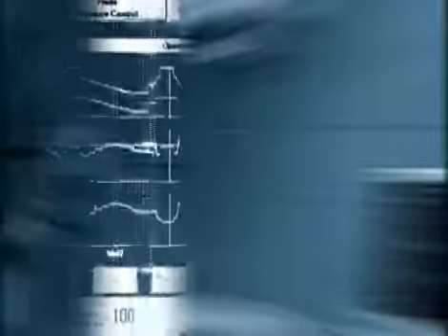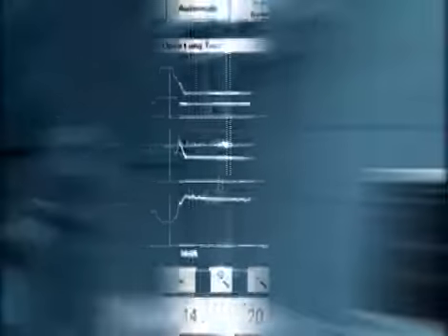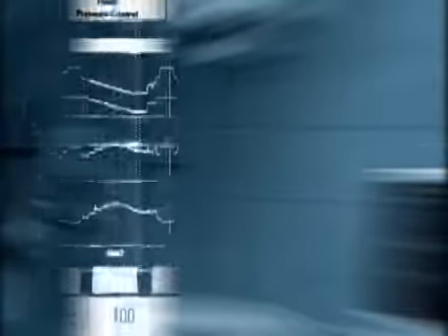This, in combination with the limitation of inspiratory pressures and volumes, provides full lung protection against the damage induced by mechanical ventilation. The clinical application of lung recruitment still remains a highly empirical process, mainly due to the lack of adequate bedside monitoring tools that are able to follow such a dynamic process.